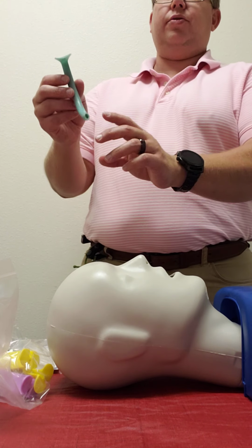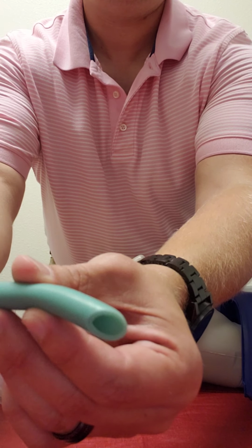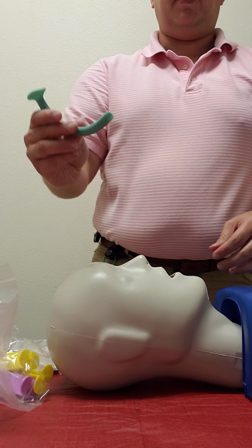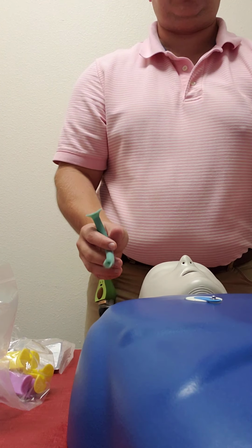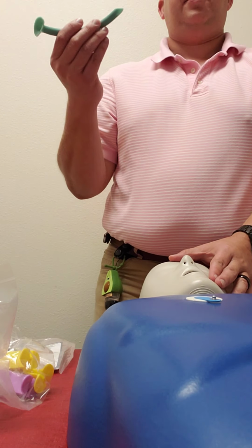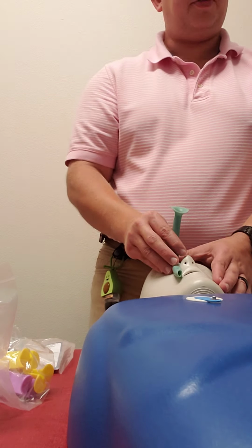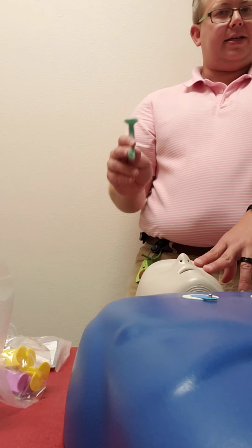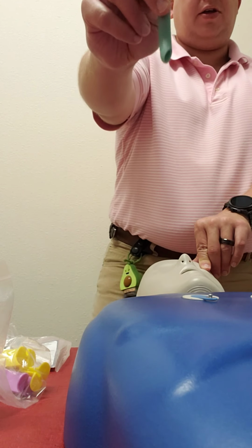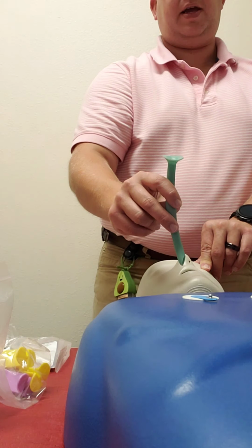You're also going to look for this bevel. As you can see, there is a bevel at the end. This bevel needs to be facing toward the septum. Now, the easiest way to remember is it's always on the right because these are all made the exact same. That bevel's going to be on the right. So you want to look at the bevel and you want it here.